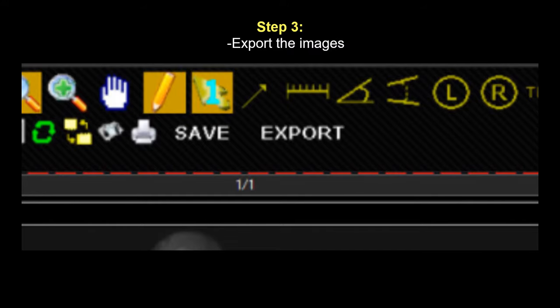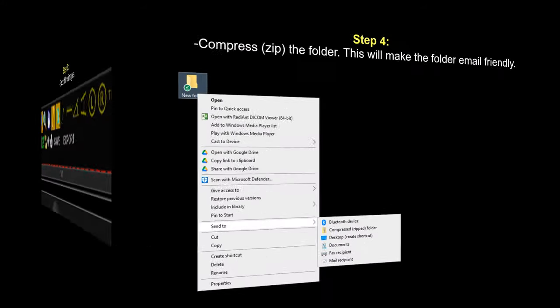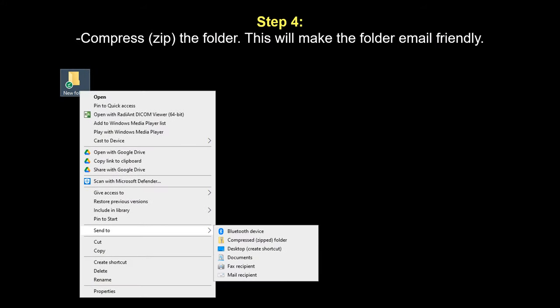Now all of the images that you saved are in that new folder on your desktop. So the next step is to compress that folder by right-clicking on the folder, hit send to compressed folder, and this will create a new folder on your desktop.